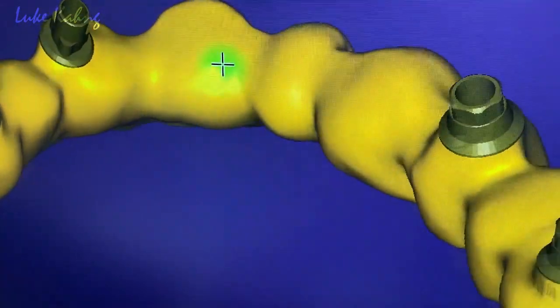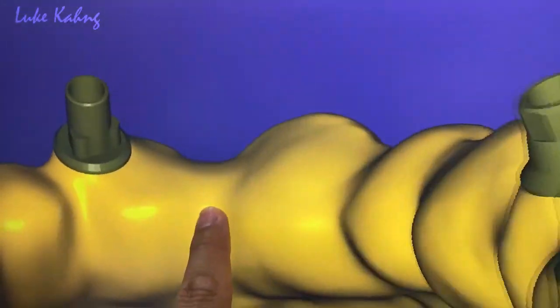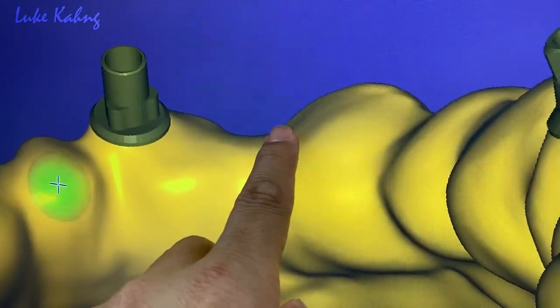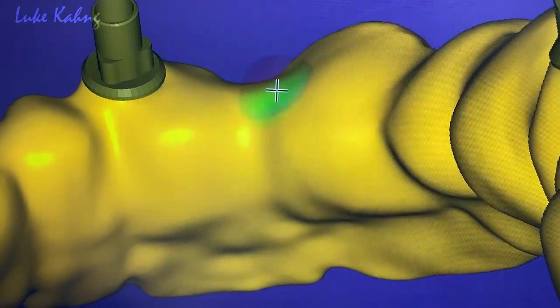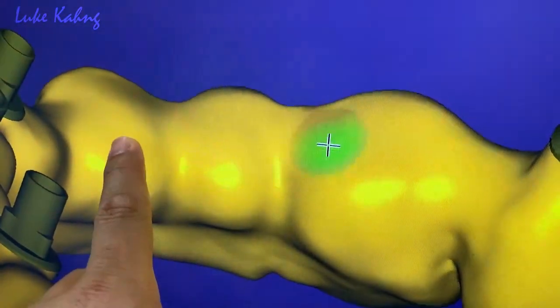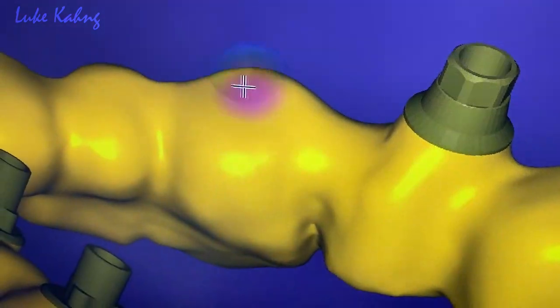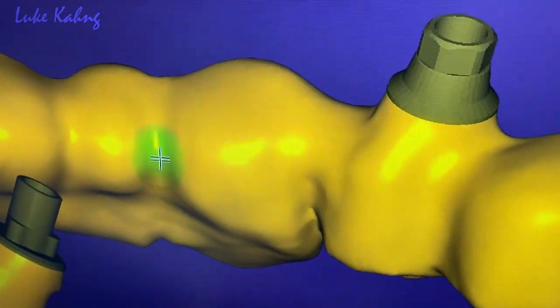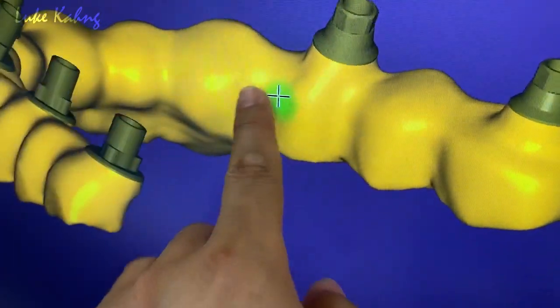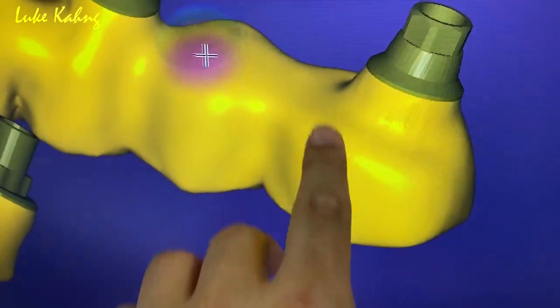The other side, one by one. That's good. Good. Just a little, just a little down there. The other side — just a little indentation here. And then maybe a little bit close in between the two. And just a little here.